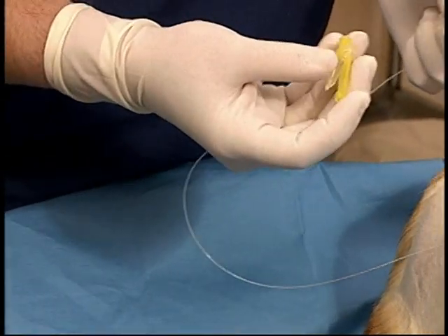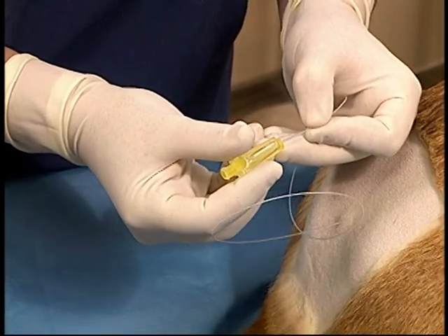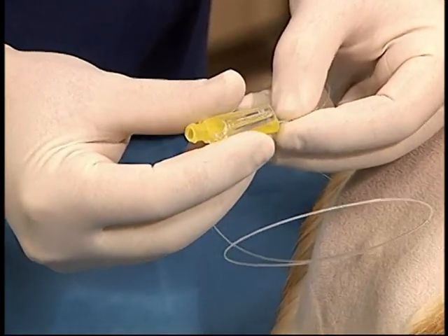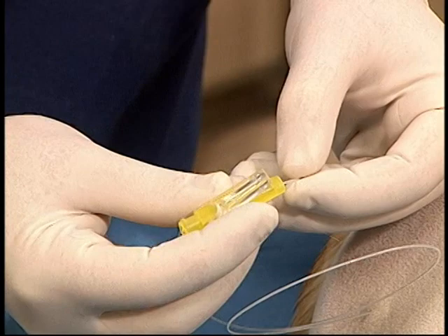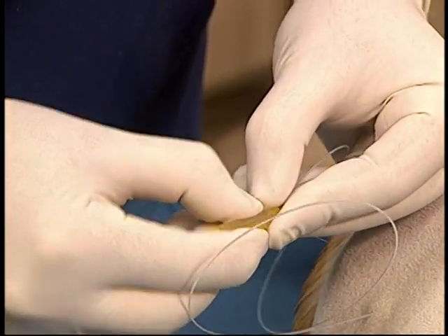The catheter is inserted into the specially designed luer adapter, and then it is snapped down to secure the catheter in place.